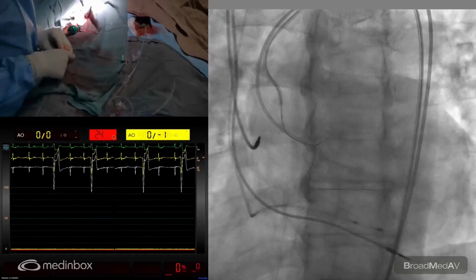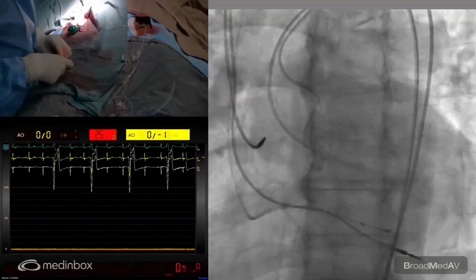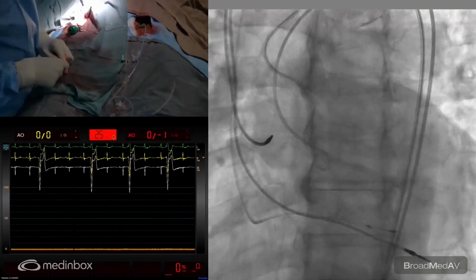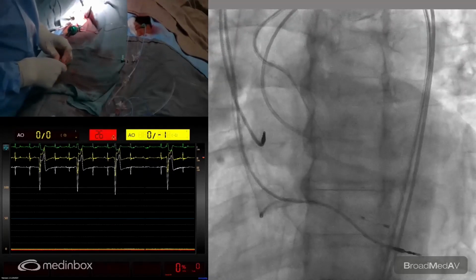Yeah, it just went in and came back. It's just flickering back, so that's the whole problem. I think it just went in and came out two times. Is it because the ectopic is jumping it out, or I don't know.